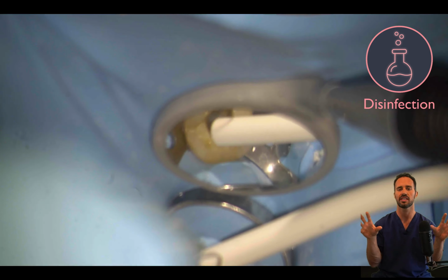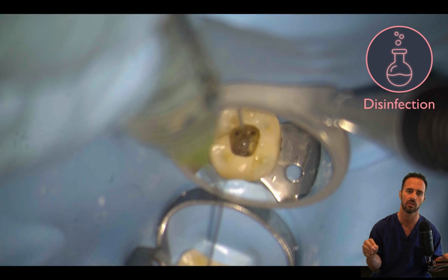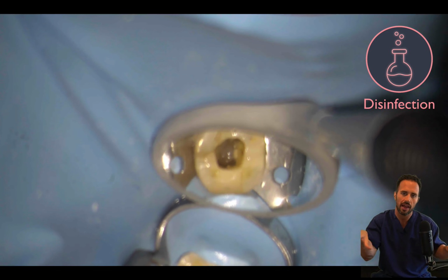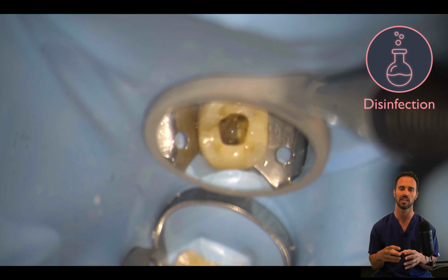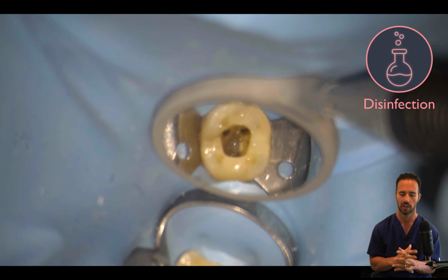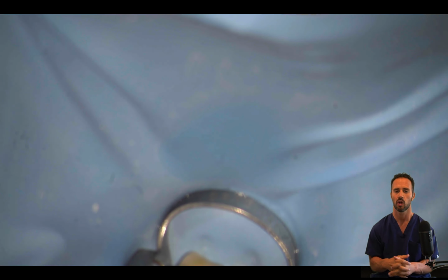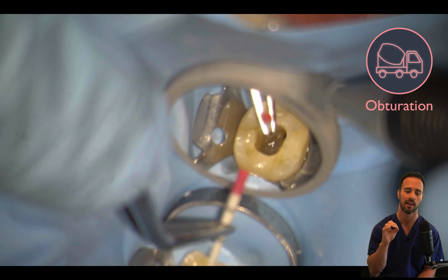And remember, the 17% EDTA is going to remove the smear layer, expose the dentinal tubules, and then your final flush with your sodium hypochlorite is going to allow that disinfecting solution to penetrate into those dentinal tubules and really get a high level of disinfection. So there we have it. We are done with our disinfection, and we're going to go ahead and proceed with the obturation phase of the procedure, starting with the paper points.